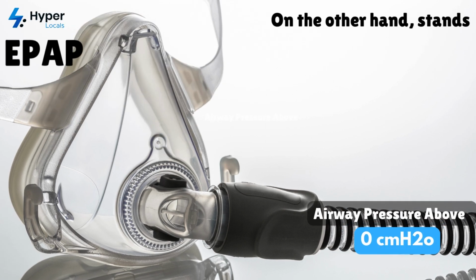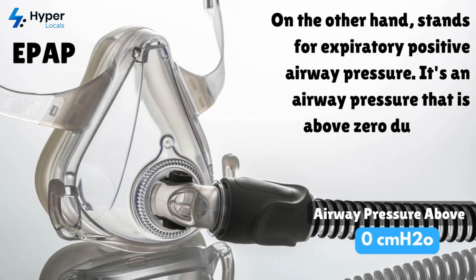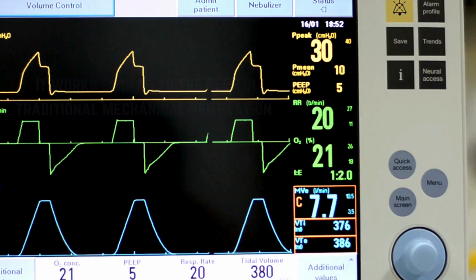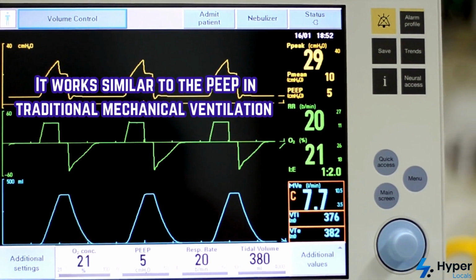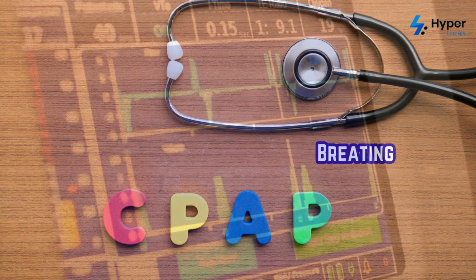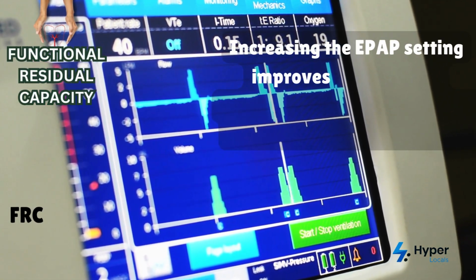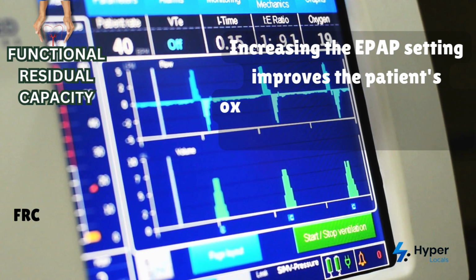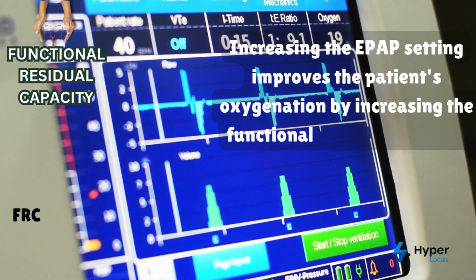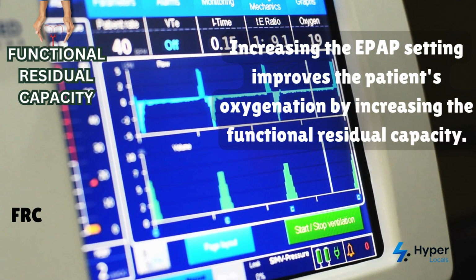EPAP, on the other hand, stands for Expiratory Positive Airway Pressure. It's an airway pressure that is above zero during the expiratory phase of breathing. It works similar to the PEEP in traditional mechanical ventilation or the CPAP during spontaneous breathing. Increasing the EPAP setting improves the patient's oxygenation by increasing the functional residual capacity. So essentially, you can make adjustments to the IPAP and EPAP settings depending on the patient's ventilatory and oxygenation status.